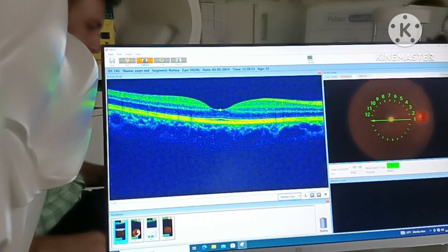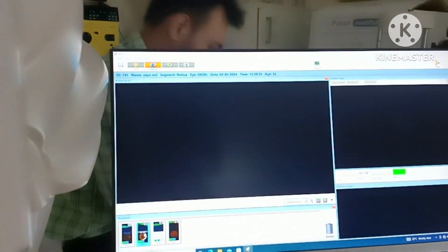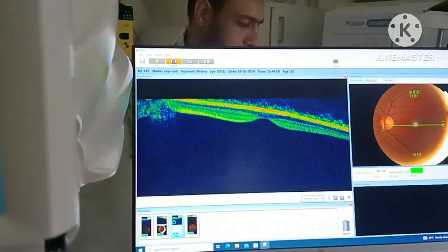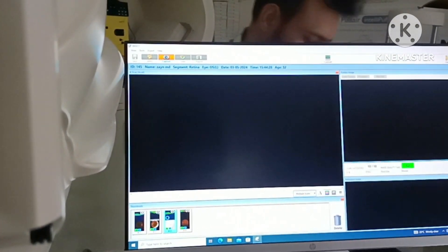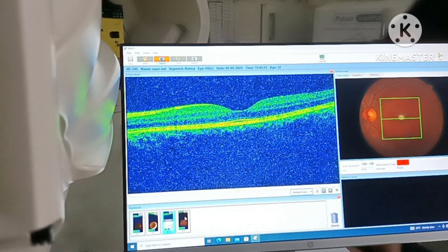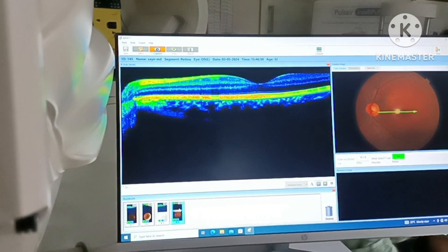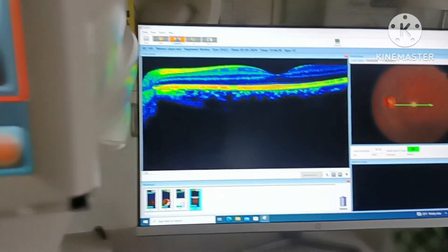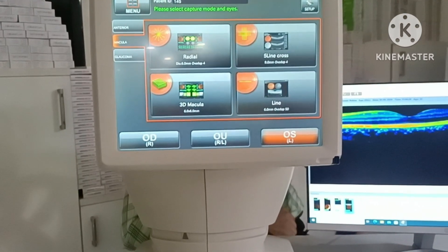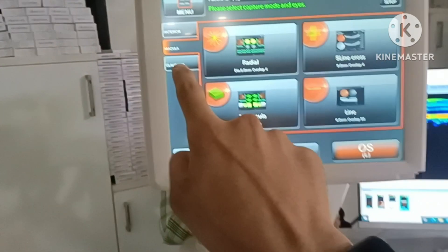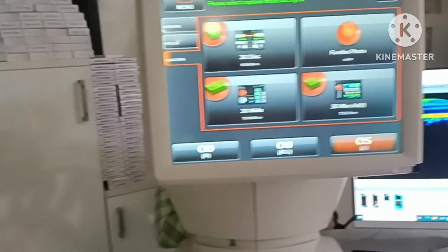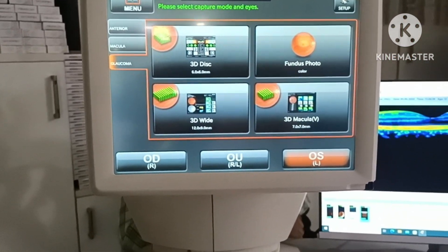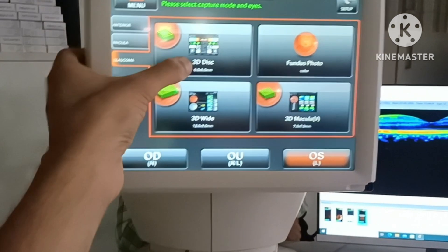First: Radial. Second: 5 line cross. Third: 3D macula. And line. Now glaucoma — 3D disc, fundus, 3D wide, 3D macula. First I will take 3D disc.